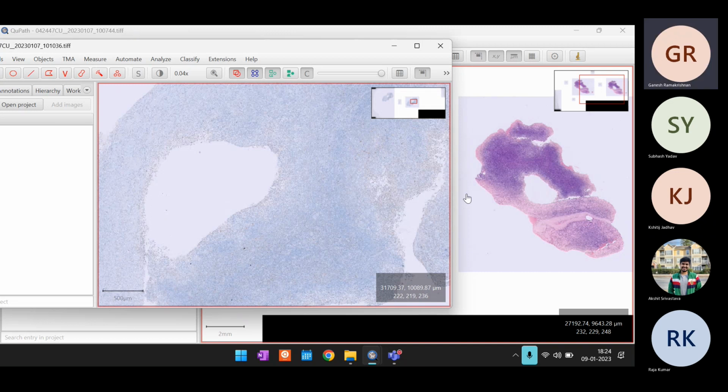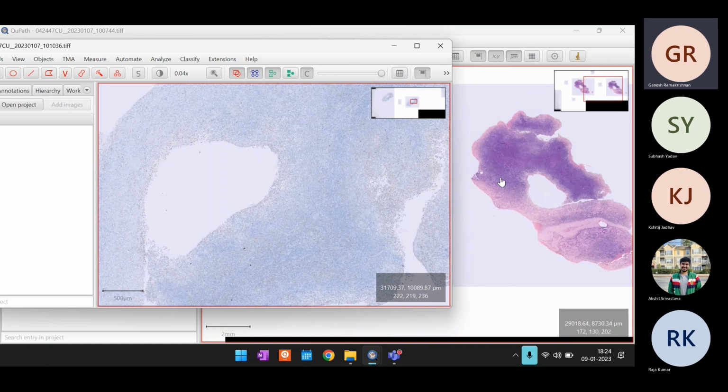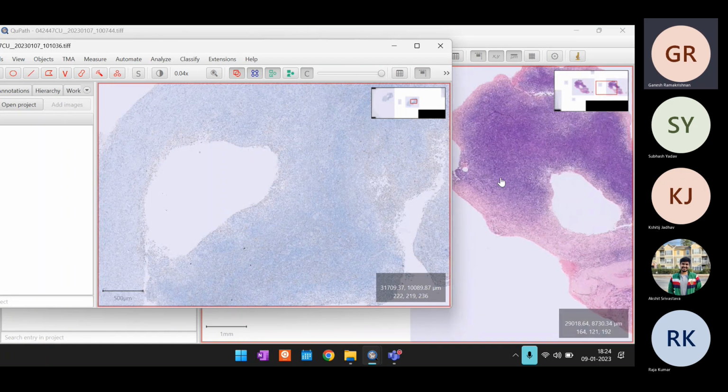Yeah, and ideally, if this is two stage, so instead of subtracting, Kshitij, what you're suggesting would have been three stages, right? First, the labeling function gets the RS cells, then subtract the RS cells, and then do clustering, right? I've short-circuited from three stages to two stages with my suggestion. But I'm suggesting if we can make it one stage, that will be even better, right? It'll be a really nice ML contribution per se.